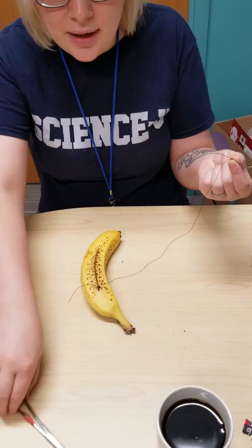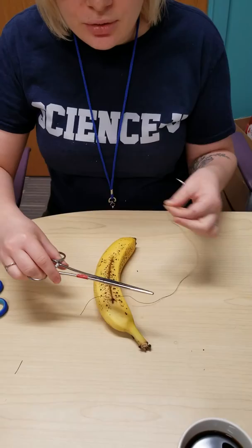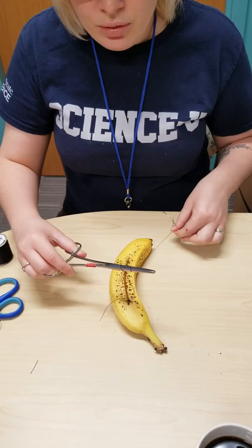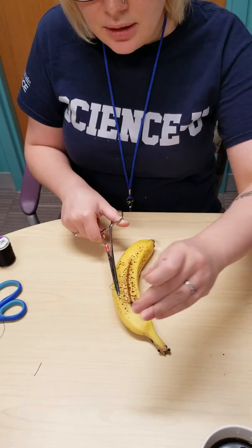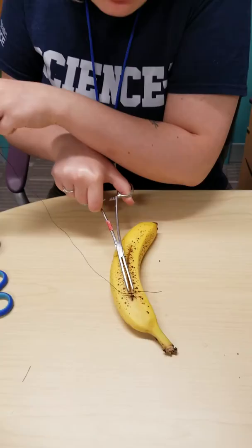Now we've got our clamp. Remember, don't squeeze it too tight and have it click and lock shut — just have it close without locking. We're going to do two loops away from us: one, two. Then open your clamp, grab the tip of the short end, pull the string off, and pull tight. If you pull too tight it's going to rip through the banana skin, so pull tight enough that it won't move.